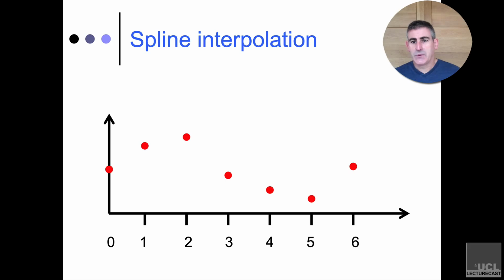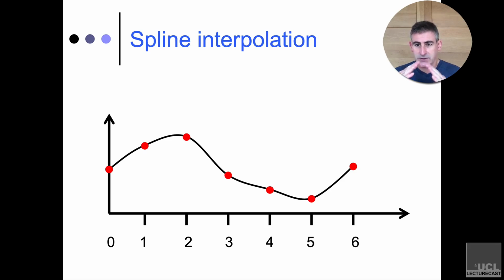It's not the optimal way to do things, though, for a variety of reasons. One of the things that people often do is something called spline interpolation. That is to say, they want to make sure that the movement curve doesn't just have these little angles in it at each point. It's smooth. And to do that, rather than using line equations, you use curve equations.